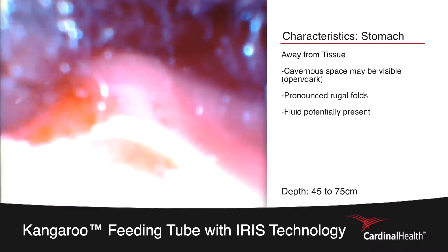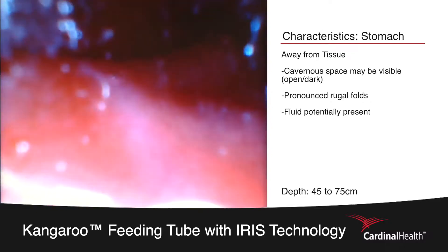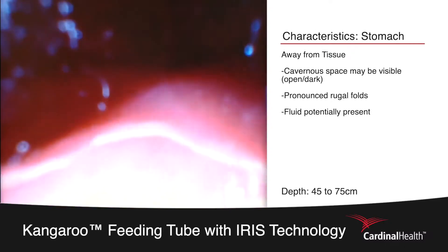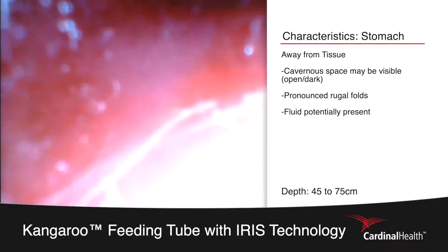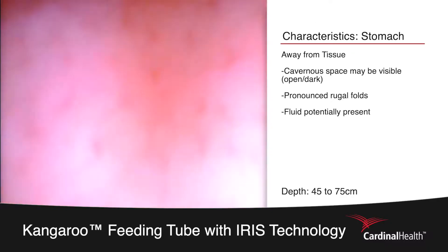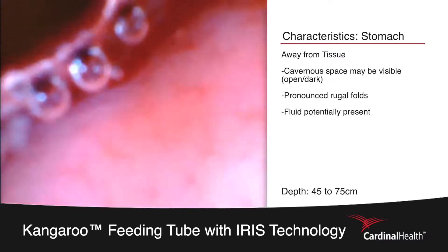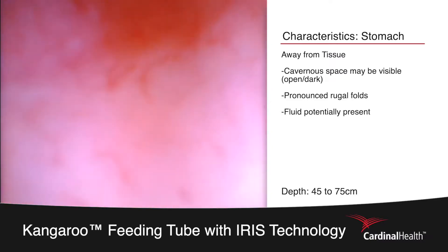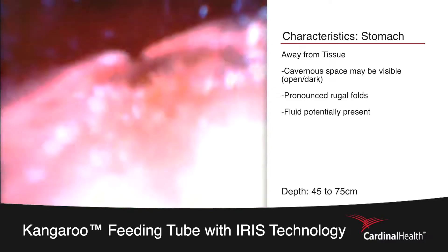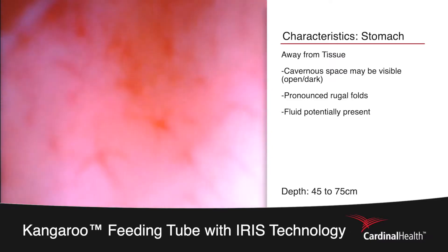When viewing the large, cavernous nature of the stomach, if there is any moisture or mucus collecting on the end of the feeding tube, continue to progress the tube up against the tissue of the stomach, which will help to resolve any visualization issues.